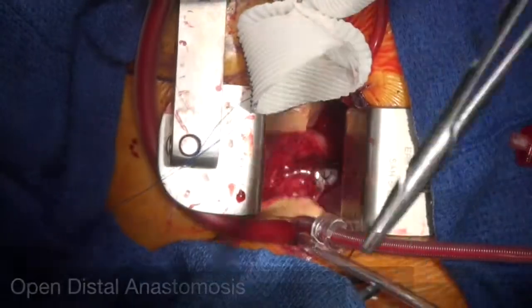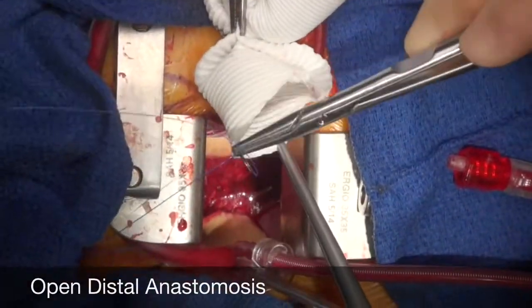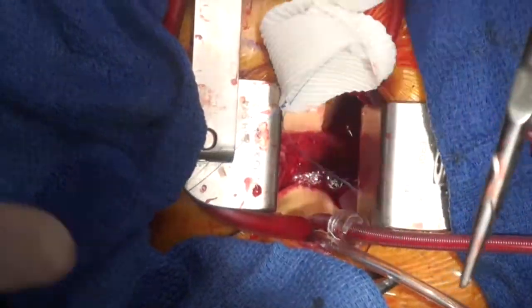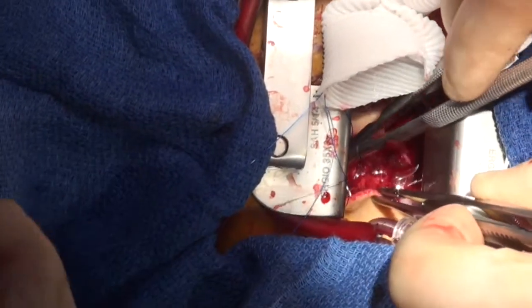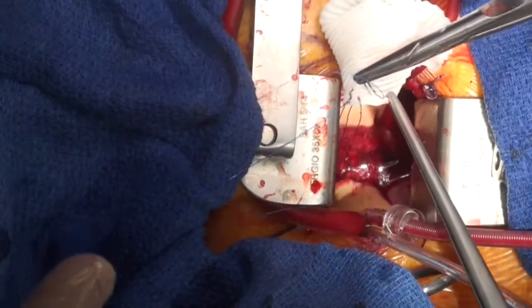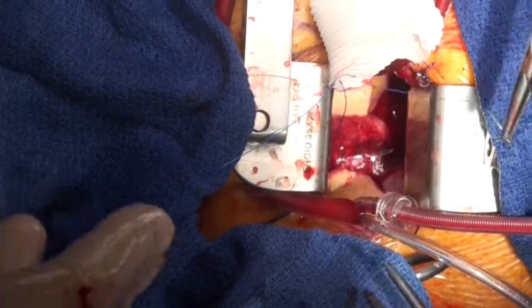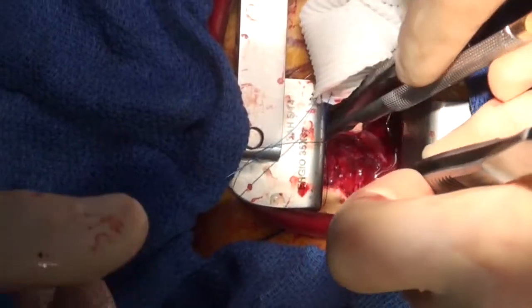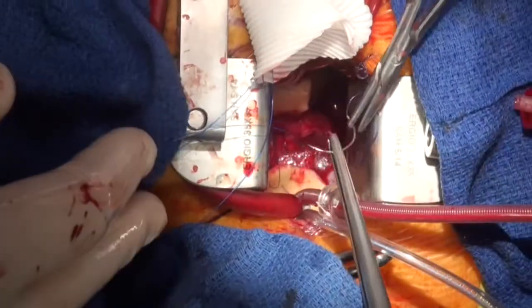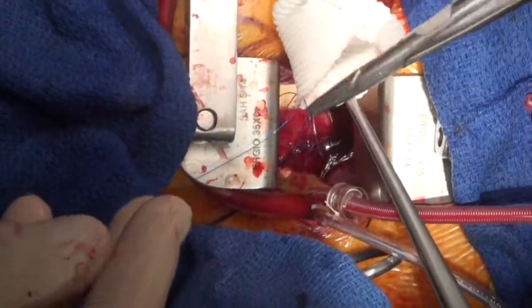He's using a 3-0 prolene suture with a continuous technique. The absolute key to this technique is that he's going to do a complete two-layered suture — the first being this continuous layer, and then he's going to perform a horizontal mattress suture after that.